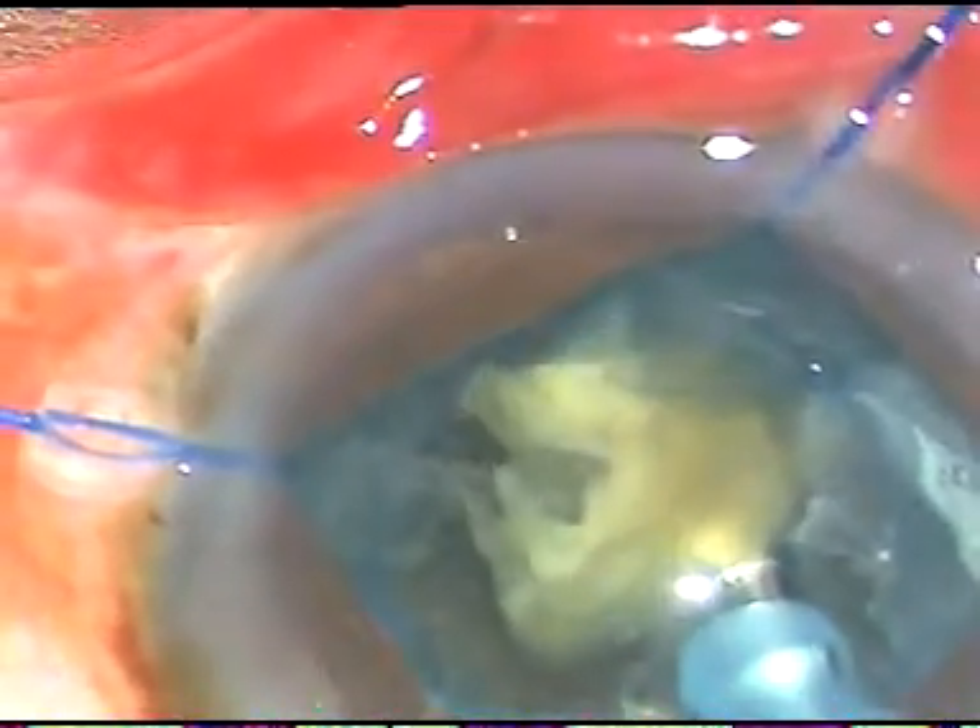As I emulsify the nucleus, you will see the posterior capsule is beautifully studded with white dots. These white dots are on the posterior surface of the posterior capsule. This patient underwent surgery of the right eye a few days back and he had similar findings. So this is a bilateral phenomenon.